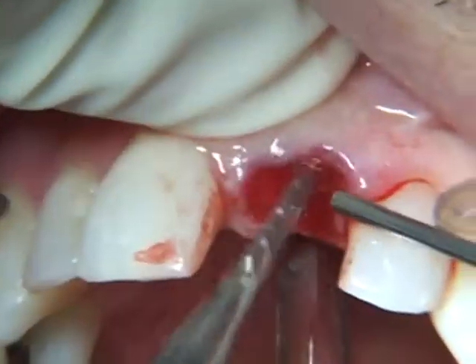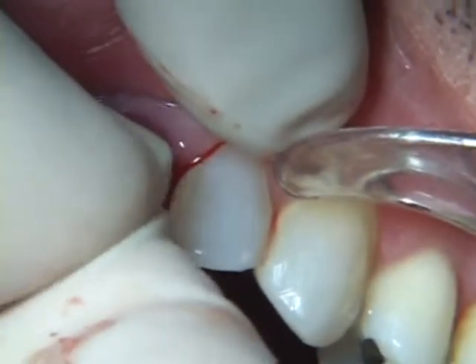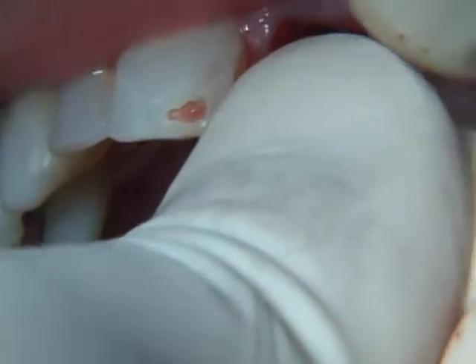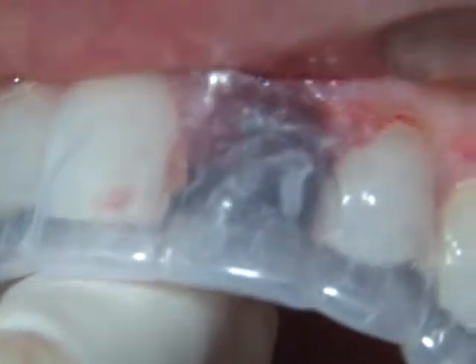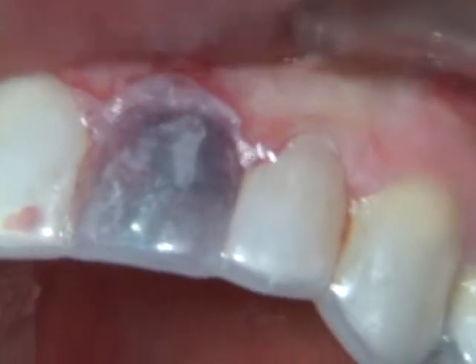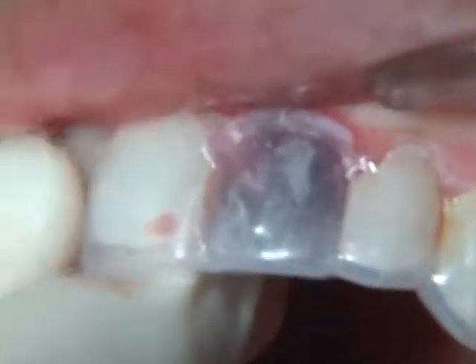After half of the necessary depth of the osteotomy is achieved, the pilot drill is removed and a paralleling pin is placed into the newly formed osteotomy to assess the positioning and trajectory of the preliminary pilot osteotomy. A vacuum form template is placed over the paralleling pin to confirm the appropriateness of the preliminary osteotomy, while it is still possible to change its trajectory.